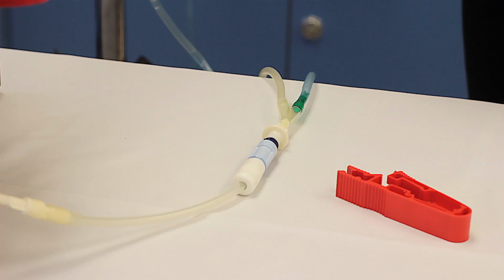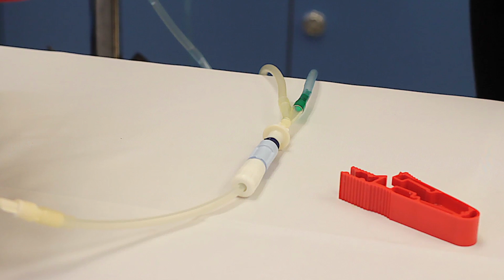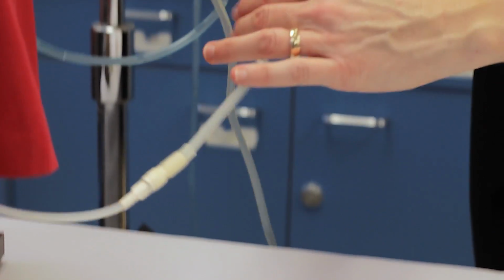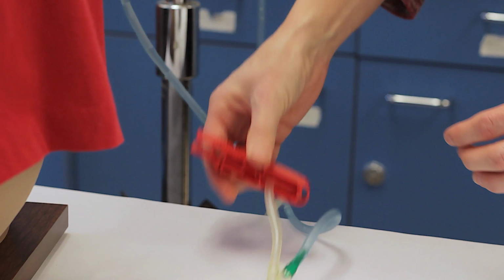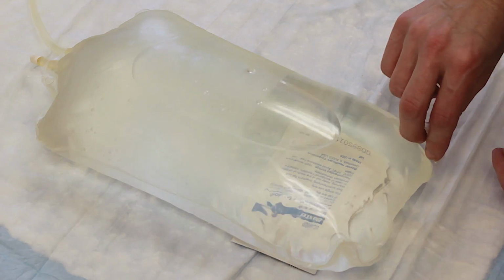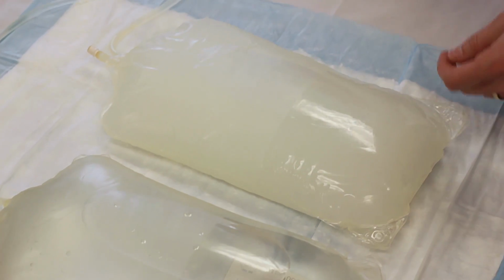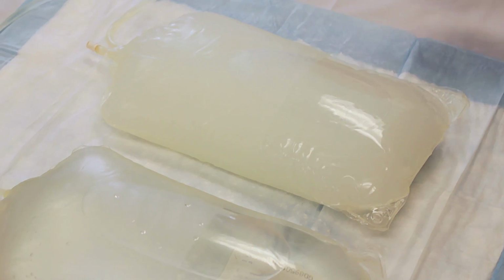You can tell the drain is complete when the drain line feels cool to touch and you no longer see fluid moving in the drain line. Once the drain is complete, close the transfer set twist clamp and apply a clean clamp to the drain line. Ensure that the drain volume is appropriate. Assess the effluent for clarity, color, and presence of fibrin through the clear window on the drain bag. If the fluid is cloudy, do not proceed with the exchange and refer to 60-30-14 peritonitis protocol.